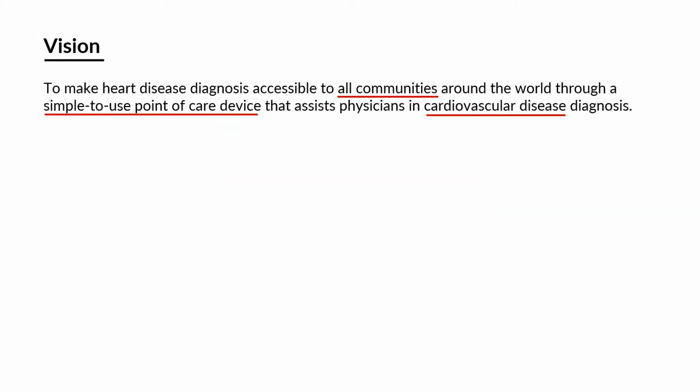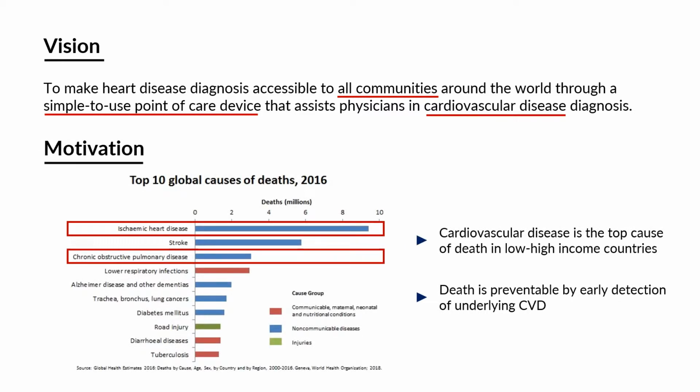This device was created to make heart disease diagnosis accessible to all communities around the world through a simple-to-use device which can assist physicians in cardiovascular disease diagnosis. This project is motivated by the fact that cardiovascular disease is the top cause of death in low to high income countries in all communities, where death is preventable by early detection of underlying cardiovascular diseases.